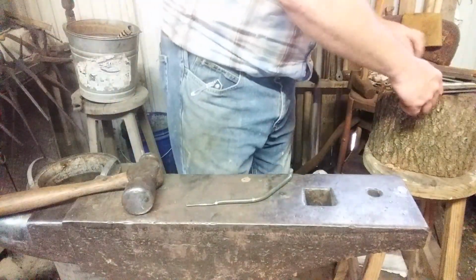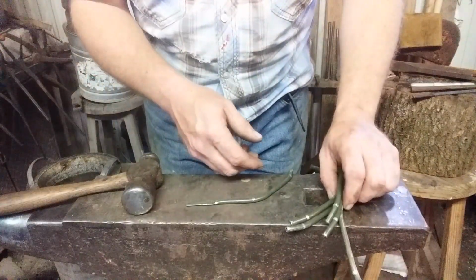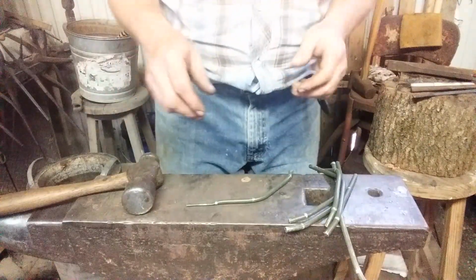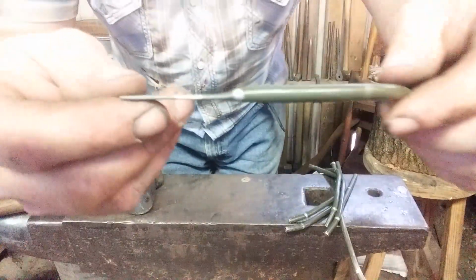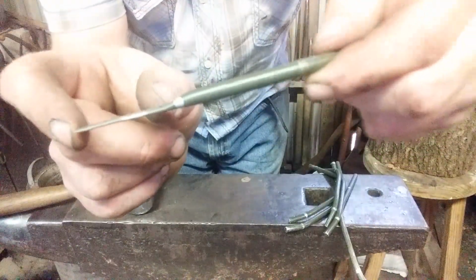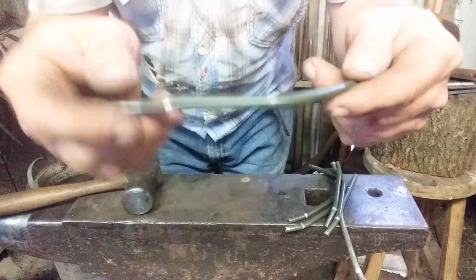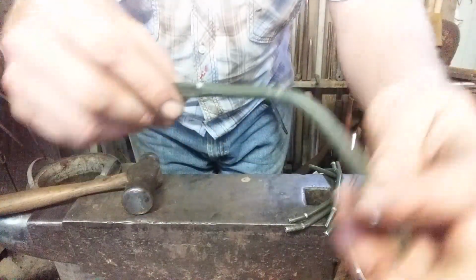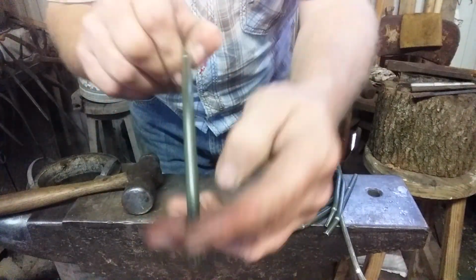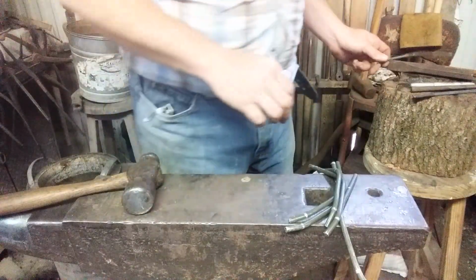So in essence, I got 6 fingers here, and I went ahead and made 14 links. If I don't need any, well, there's no big waste. So you see I've offset this to one side a little bit longer than our link pieces, that way it has room to fold. So 3 of them will have to be offset to the left, 3 of them will have to be offset to the right, and vertically as the finger works. So I'm going to do a little bit of that and let you see.